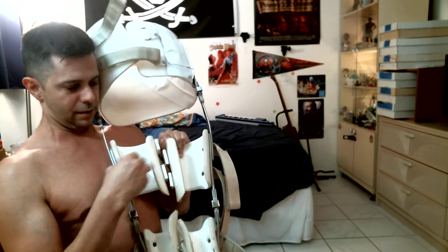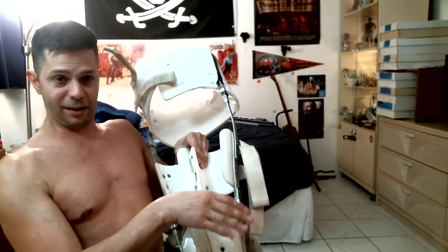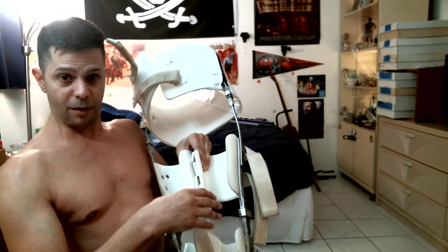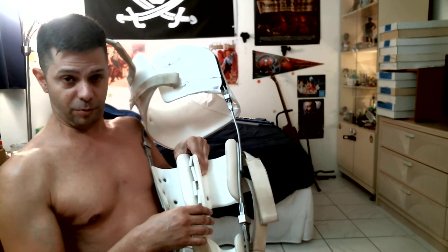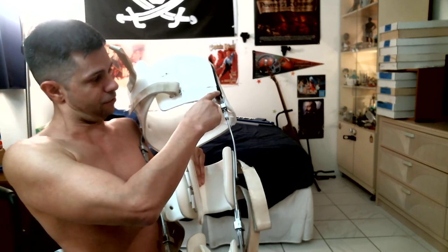It actually fell out — the left leg fell out completely — but I was able to put it back in. I need to fasten it or retape it.